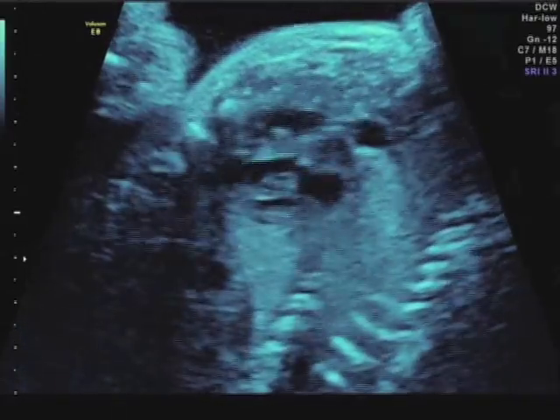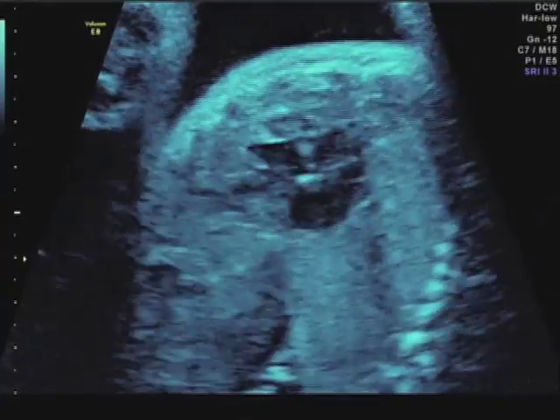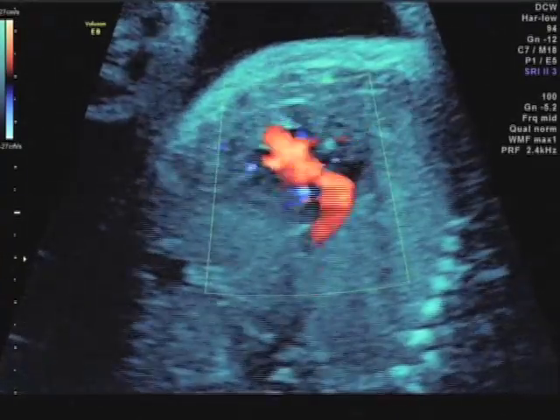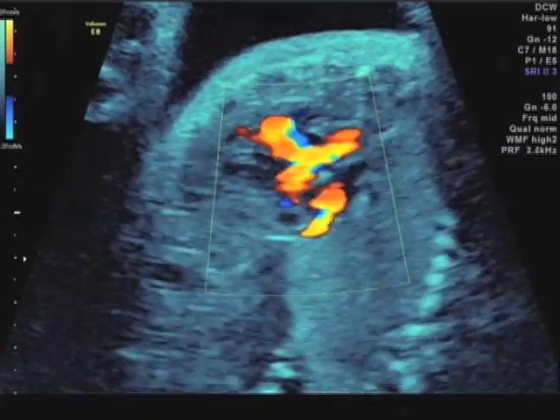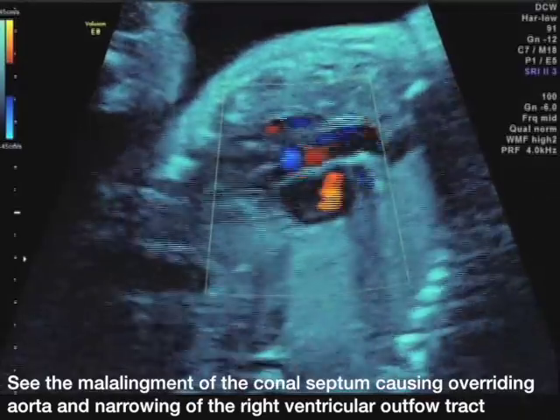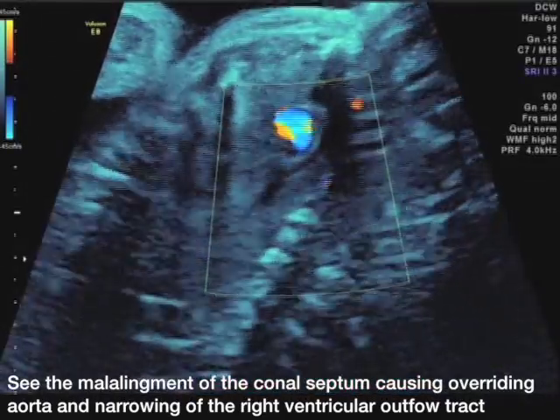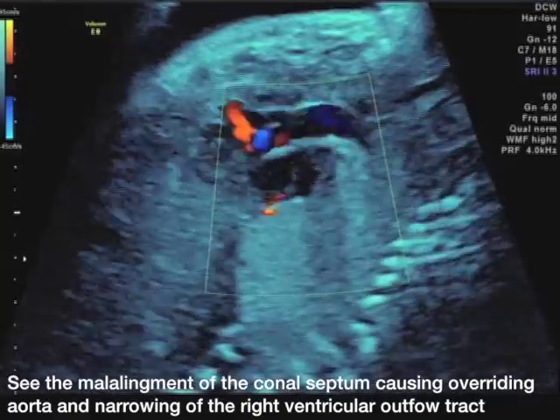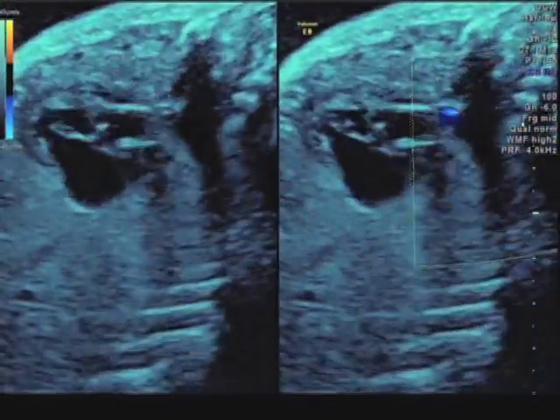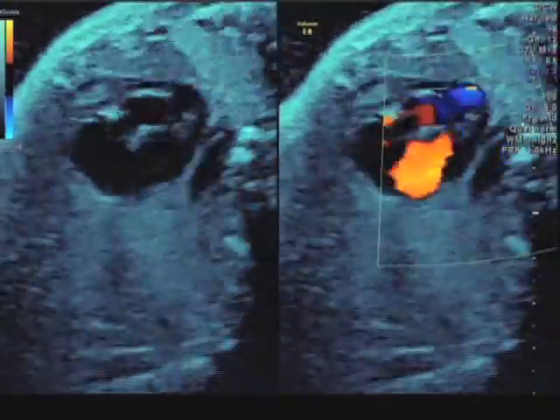One needs to make sure it's not a right aortic arch. And you also want to see if there is a ductus arteriosus that is flowing from pulmonary artery to descending aorta rather than from the descending aorta back into the pulmonary artery, which would suggest a more severe type of Tetralogy of Fallot. And patients like this, we follow right through until delivery just to make sure that the right ventricular outflow tract does not get smaller.